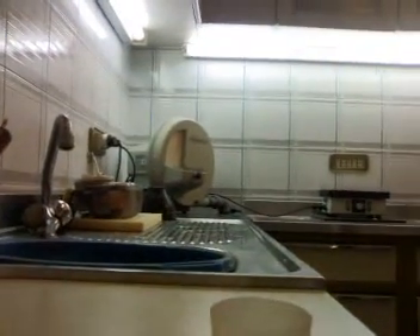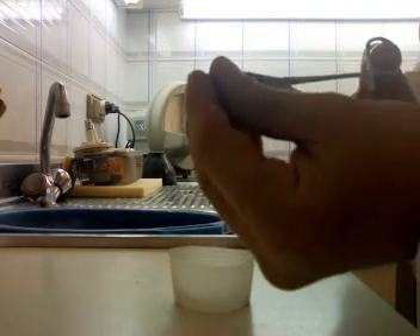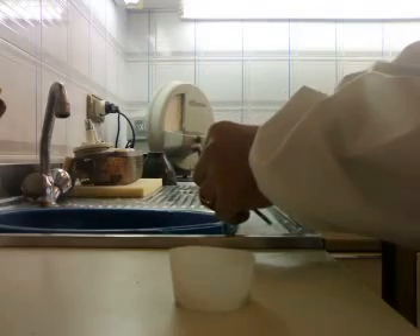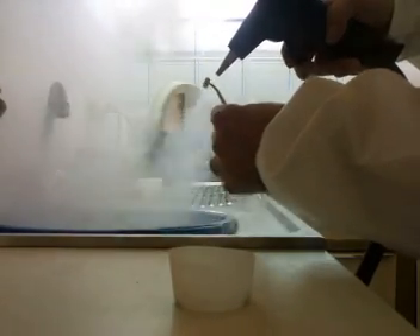Now I steam clean my crowns. The steamer is on — we can see that — and I can proceed. I take my crowns — I can take them with my hands also in this case. I just go over the steam and make sure my surface is nice and clean.